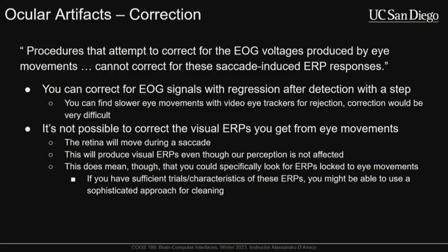So again, it's a scenario where some of these things are artifacts sometimes, but they can be useful signals if you design your experiment in such a way to utilize them or depend on them.